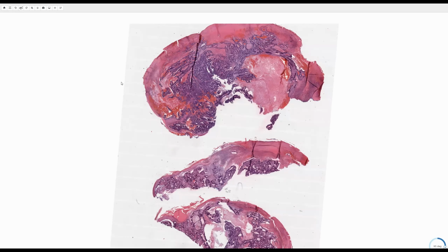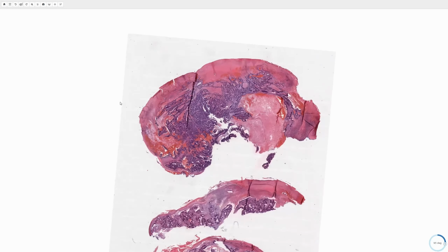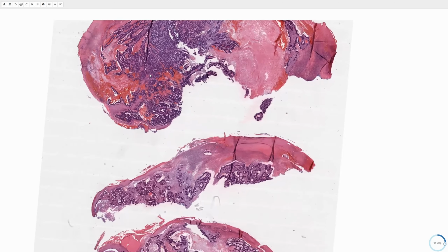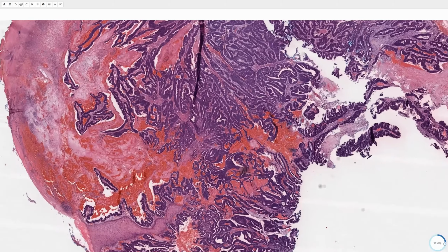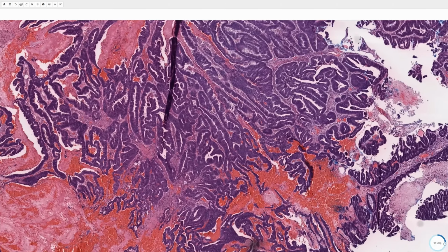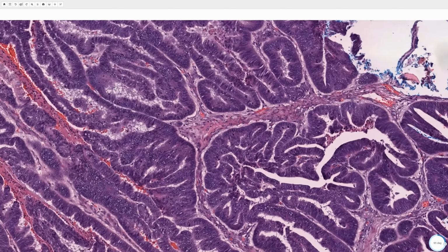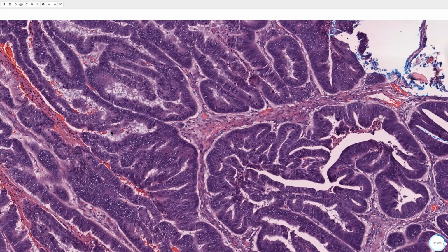So moving on in the category of adenocarcinomas, here we have an ulcerated nodule, and you can see at low power, there's somewhat adenoid or cribriform architecture, and still relatively well differentiated. But when we go up in higher power, you can see that this is recreating some tubulovillous structures, and there is some pink secretory material here with a few neutrophils in the lumen. In this case, we have a metastatic colon adenocarcinoma, where the metastasis is typically seen in the areas of the abdomen or the perianal area, usually well differentiated, and you may see some mucin, like you can see here.